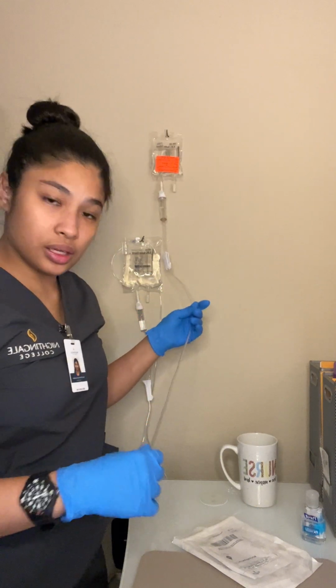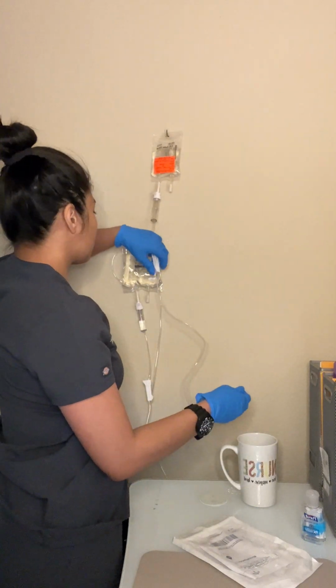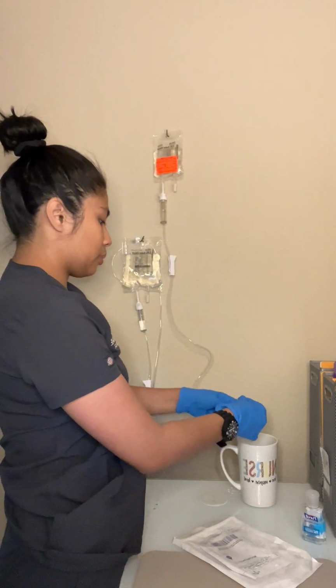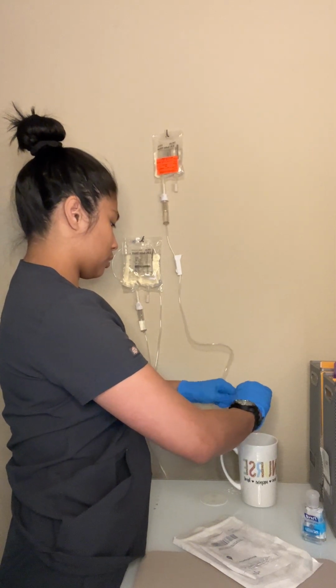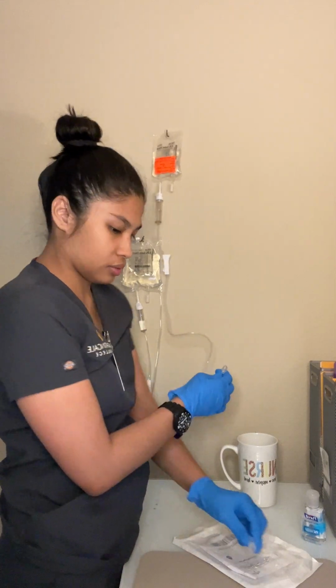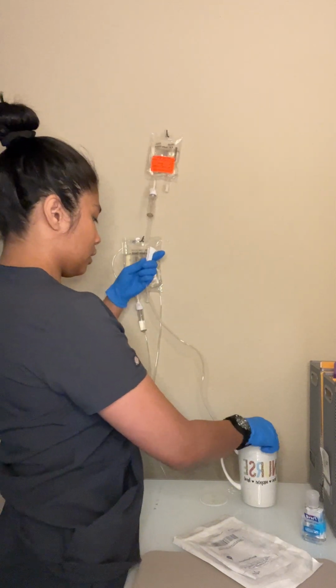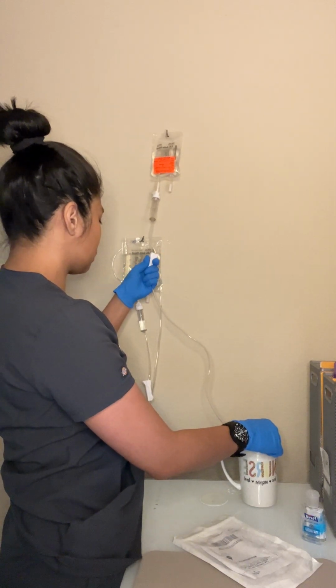Same as what we did with the fluid, we'll be priming this slowly. Slowly prime it, making sure there are no air bubbles.